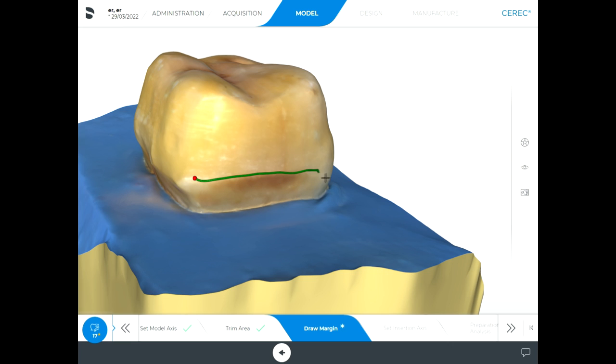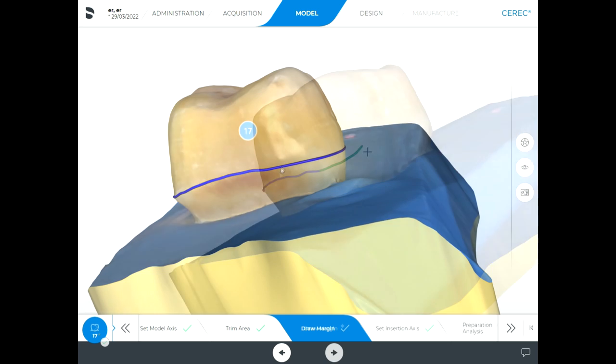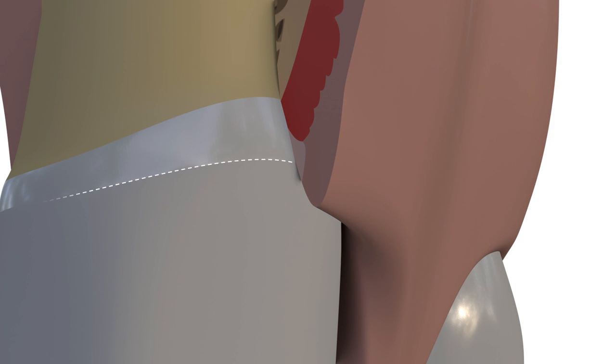In such a prepared tooth, even a software program can determine the margin line, as seen in the video, so that the crowns are not over-extended into the gingival. However, it is a must to make adequate gingival retraction to obtain an accurate impression of this line.